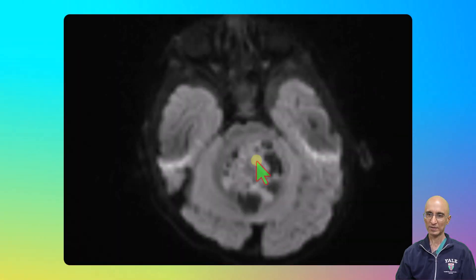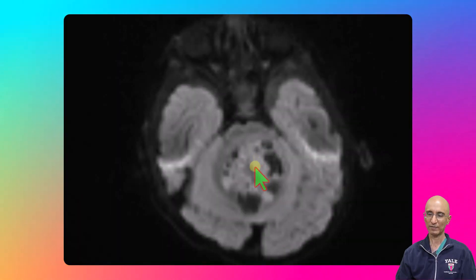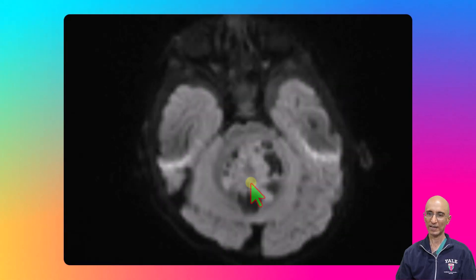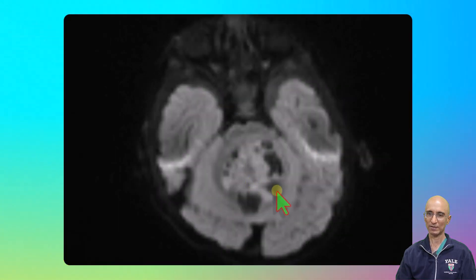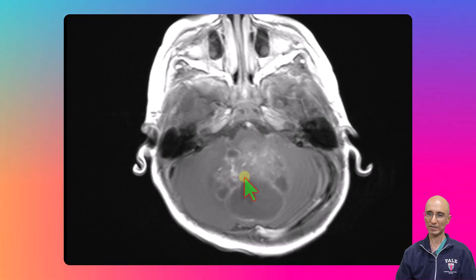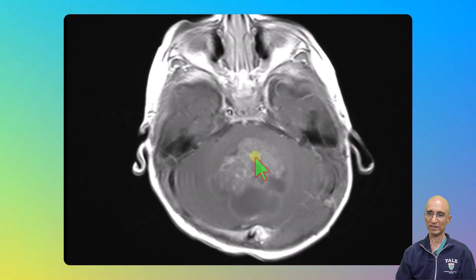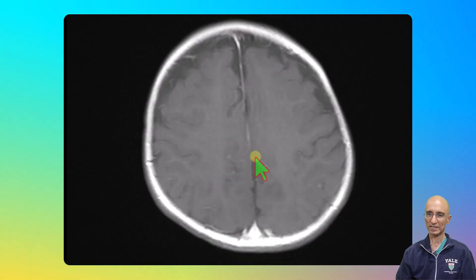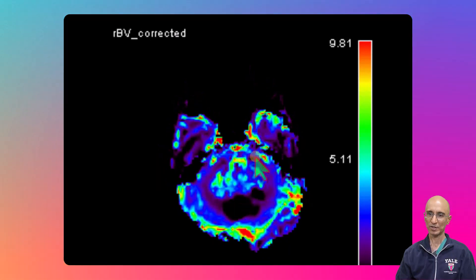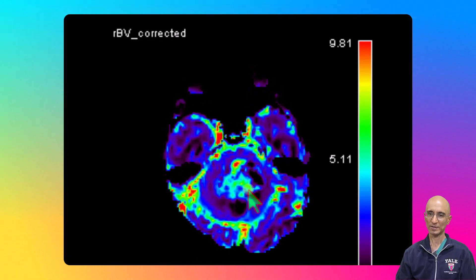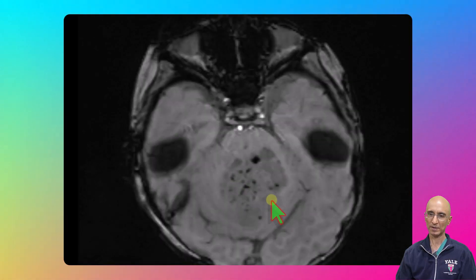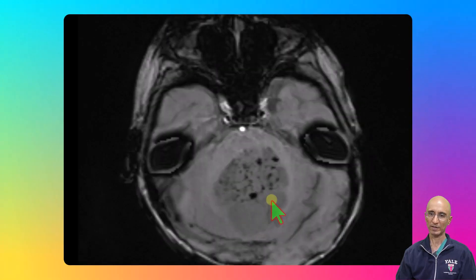On the DWI sequences we can clearly see restricted diffusion within the solid portions of this lesion. Again we can identify the multiple peripheral cystic foci. Following administration of intravenous contrast, there were patchy regions of enhancement in the solid portions of the tumor. There were no metastatic lesions identified. Perfusion imaging demonstrated increased tumoral vascularity in the solid portions, and SWI images demonstrated multiple internal foci of susceptibility suggestive of microhemorrhages.